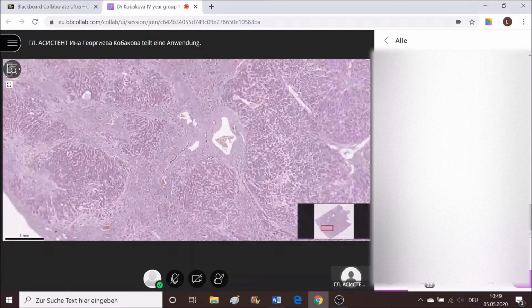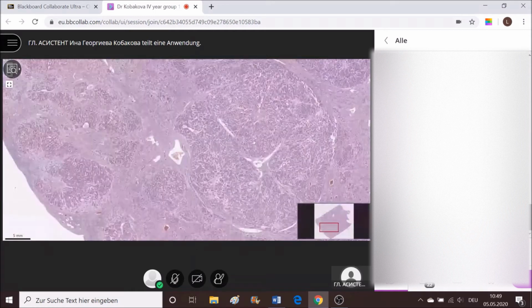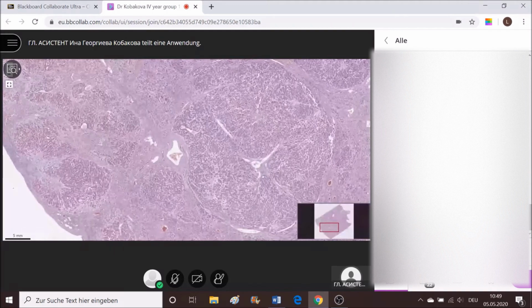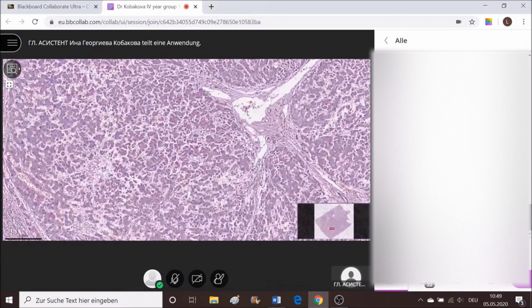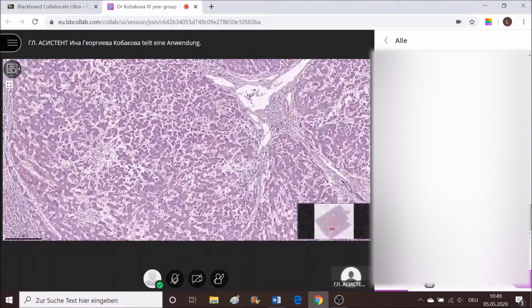It should be positioned at the periphery of a hexagonal structure, which should not be surrounded by such thick fibrosis, and there should be centrally positioned the central vein, which we can observe actually here, but it's a little bit damaged. And again, proliferation of bile ducts could be observed. This is what we observe. Let's take a look at a smaller nodule now. Again, proliferation of bile ducts at the periphery with no specific structure.